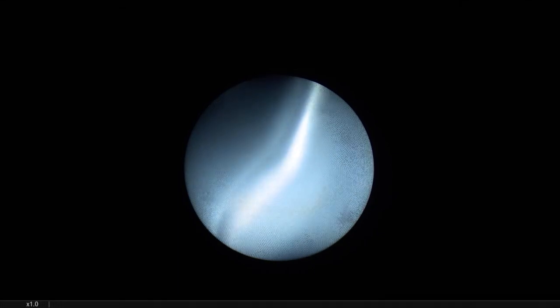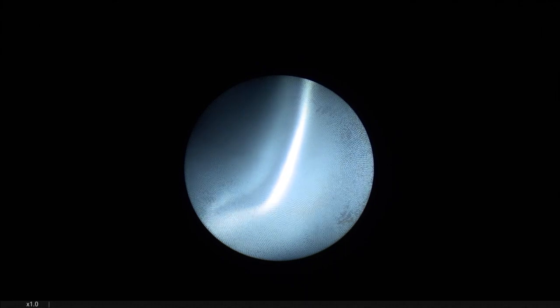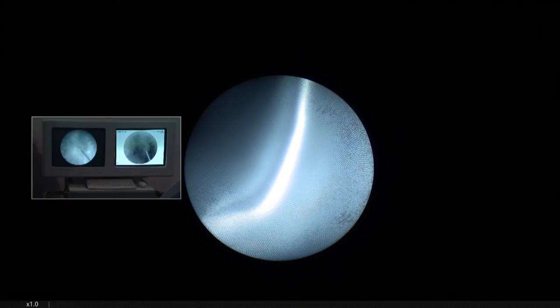So you will do another second dilation. Then we were using a larger nephroscope. No, no larger nephroscope. Yes, I know.